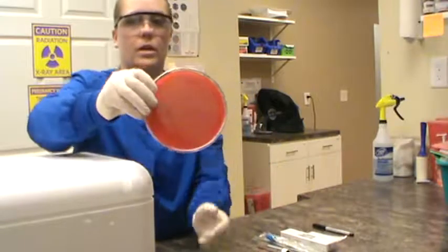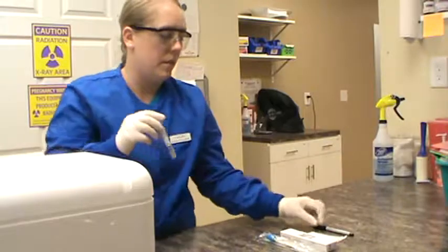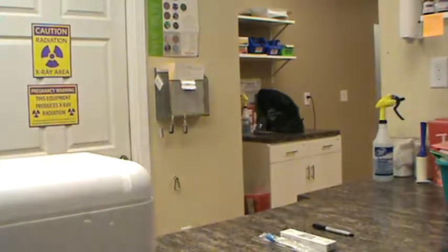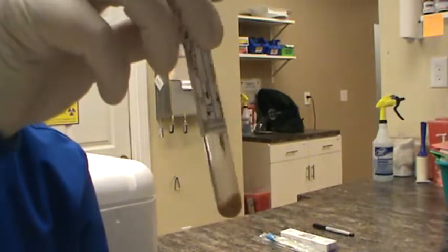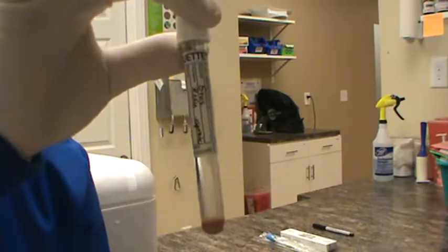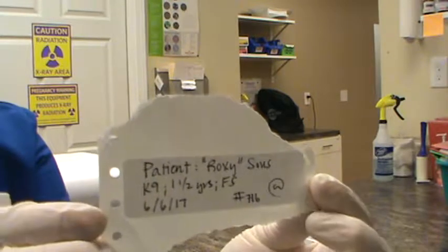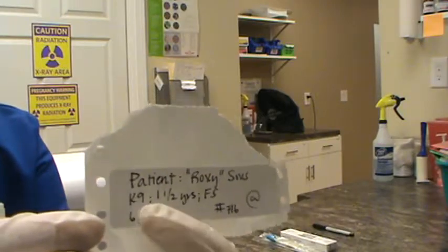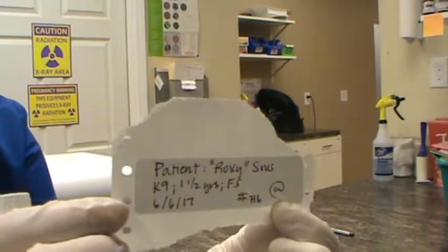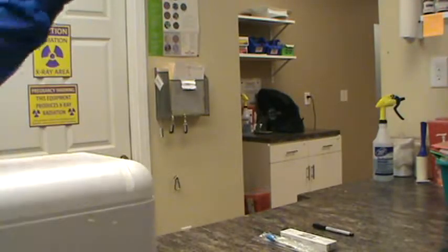We also have our blood agar petri dish here. We have our patient sample. I'll bring that closer. It's an aspirate from Roxy. She had a kind of gross oozy lesion that we're going to culture. And then we have our patient label for that agar plate. So we have the patient name, number, client number here. We have the date and my initials, showing I'm the one that started the culture.